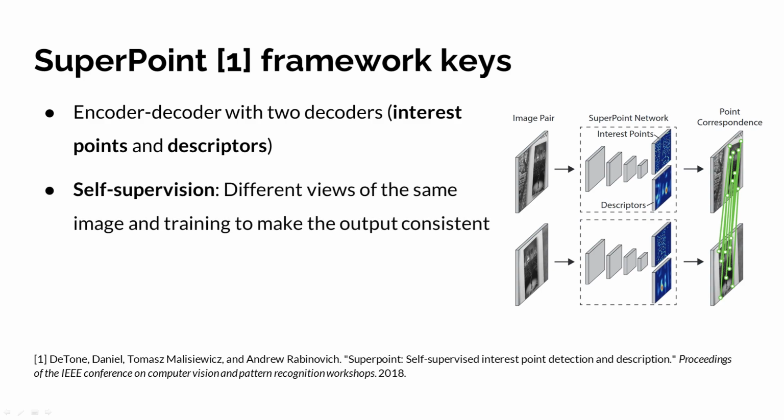A very important aspect of SuperPoint is that it is completely self-supervised. It uses different views of the same image, and since we know they represent the same scene, we train it to make the output of the network consistent. This way, we obtain a feature extraction network that doesn't need supervision at all, which is great for us because we don't have supervision for correspondences in endoscopy images.